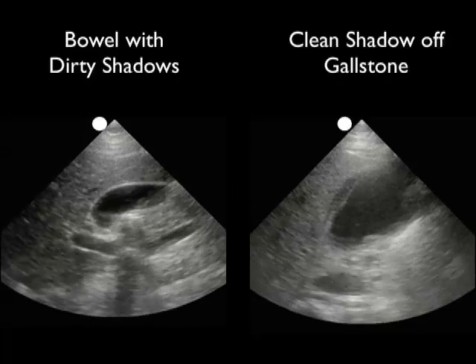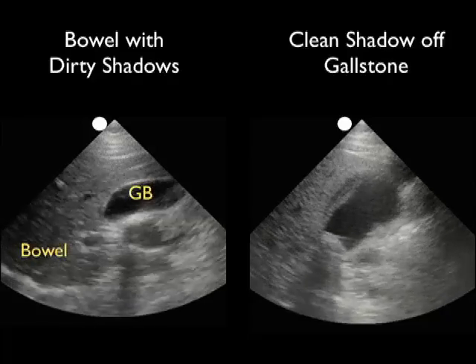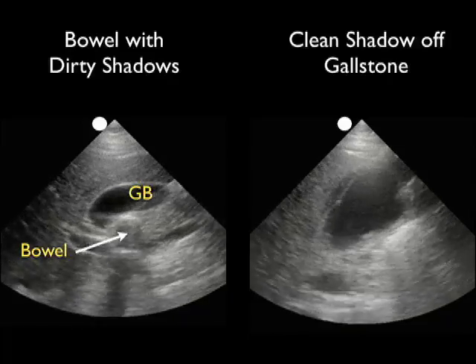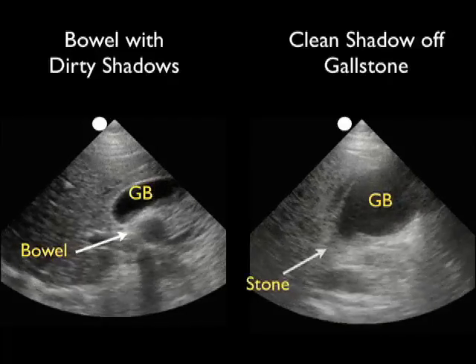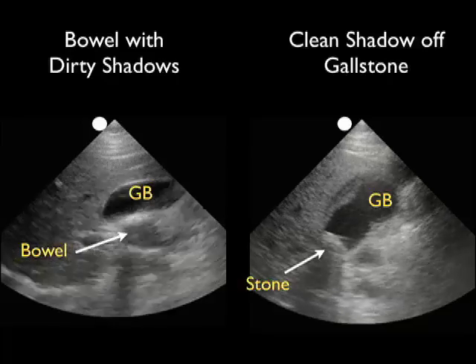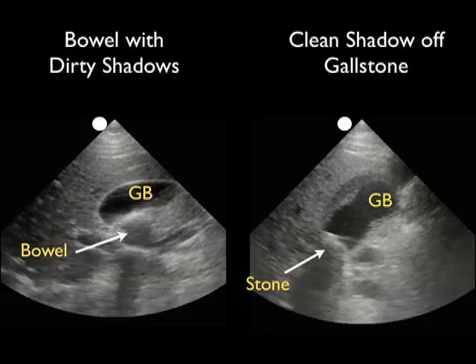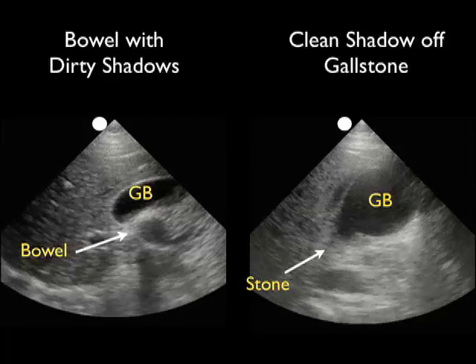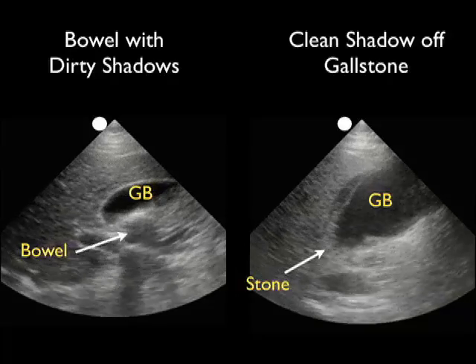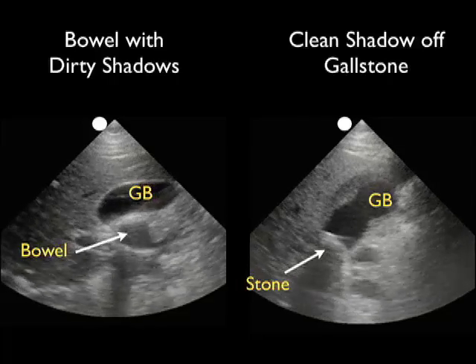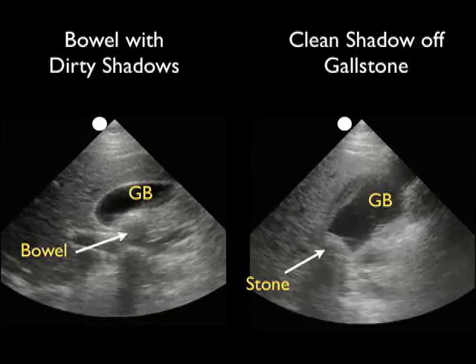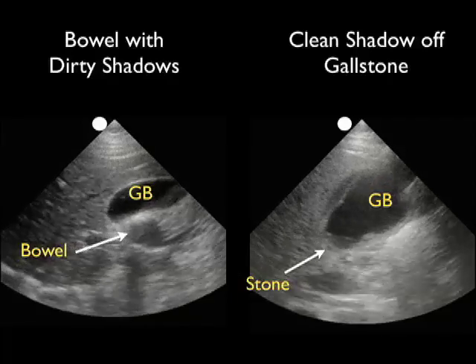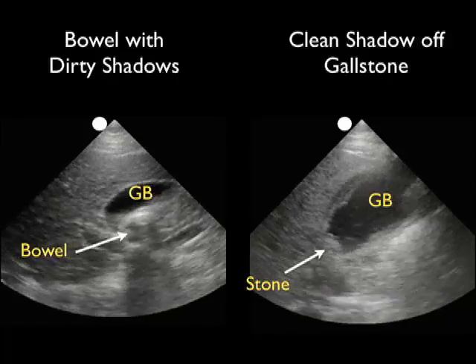One potential pitfall on right upper quadrant sonography is that occasionally a loop of bowel may come right up against the wall of the gallbladder and be mistaken for a gallstone. In the video clip to the left, we see a loop of bowel against the posterior wall of the gallbladder with a bright hyperechoic appearance that could be mistaken for a gallstone. However, the loop of bowel is clearly outside the gallbladder wall. Also, the shadows coming off the air-filled bowel are dirty shadows — not completely dark, with areas of white within the dark areas. In the clip to the right, we see an impacted gallstone at the neck of the gallbladder, hyperechoic and within the lumen, with a clean shadow — completely dark — without those light areas that characterize air shadows.